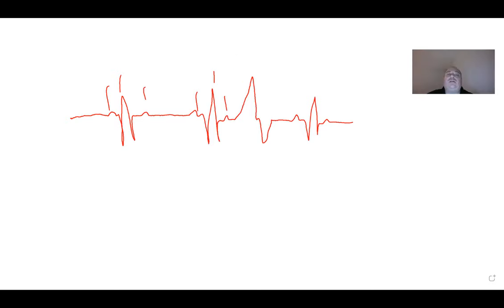Well, what you're looking at here is that the ventricles, right after they repolarized here, depolarized again way too soon. In fact, they depolarized before the atria ever did anything. So you don't even have a P wave, okay? The ventricles popped off before it was their time. All right, so we're going to call that a premature ventricular contraction. And what's the hallmark of a premature ventricular contraction? Well, something happened too soon in the timing pattern, of course, but it's going to be a wide QRS. That's the key. It's going to be a wide QRS.